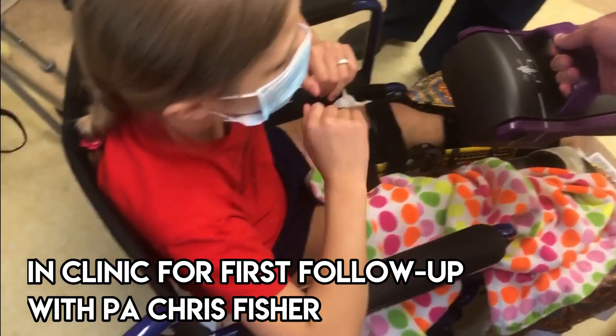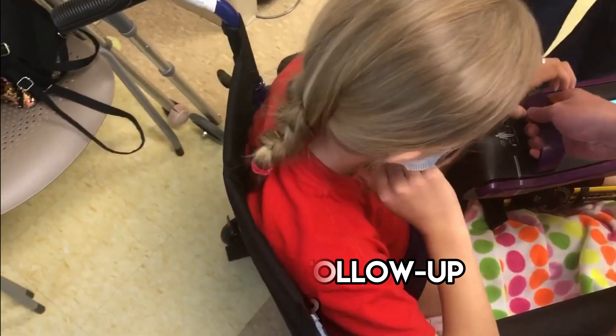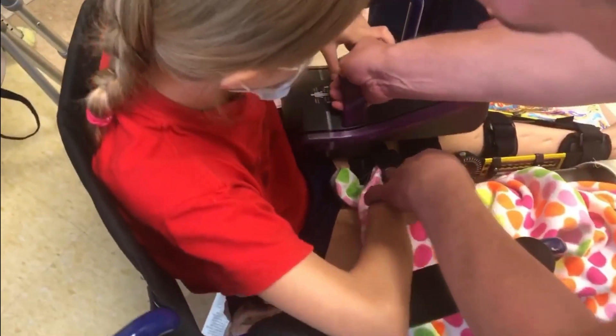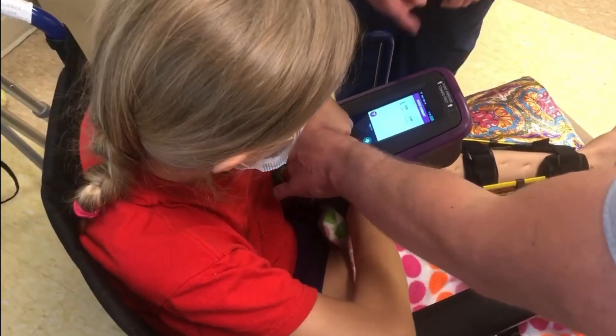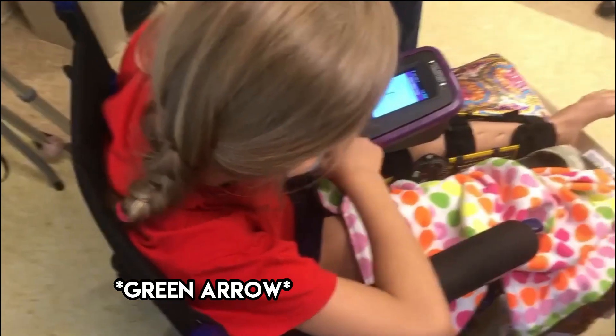All right, let's go for it. If you want to press the button — so the line goes. There's your lines, so you'll line the lines up. There. You can hold it, that's fine. And hit the little red arrow. There we go.